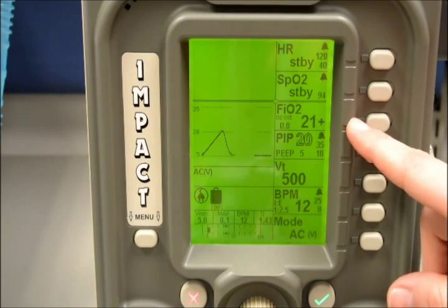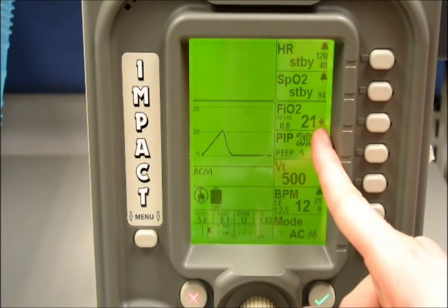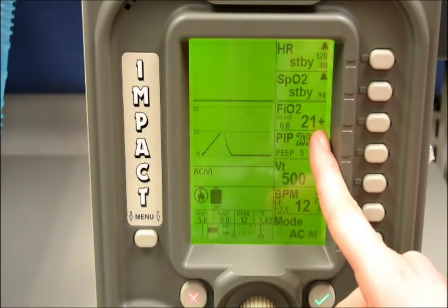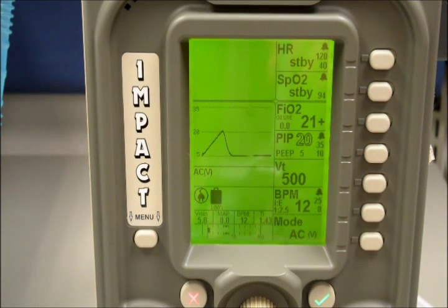As a visual reference to know that you are on low flow, there is a positive sign right next to the FIO2. And that is how you set up low flow.